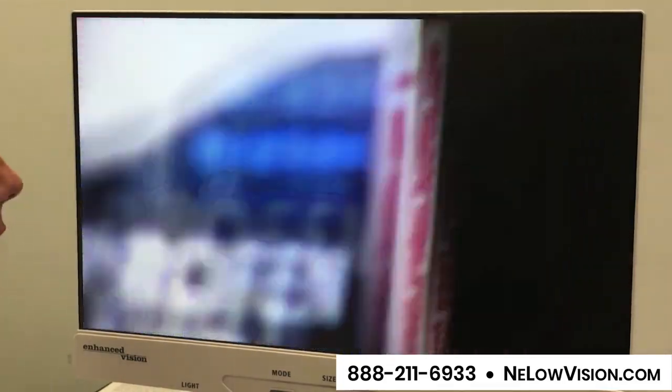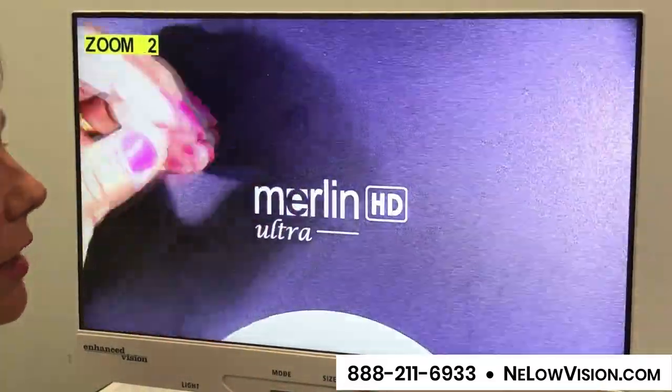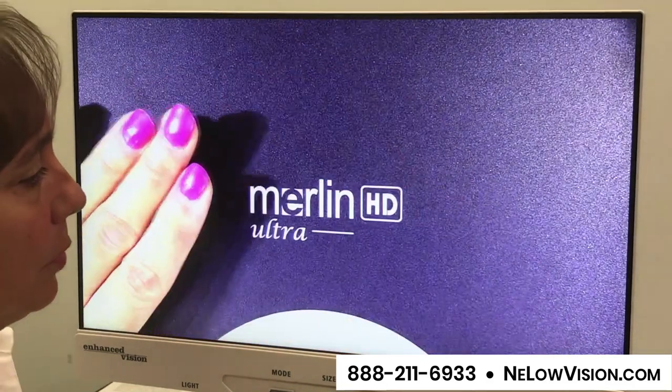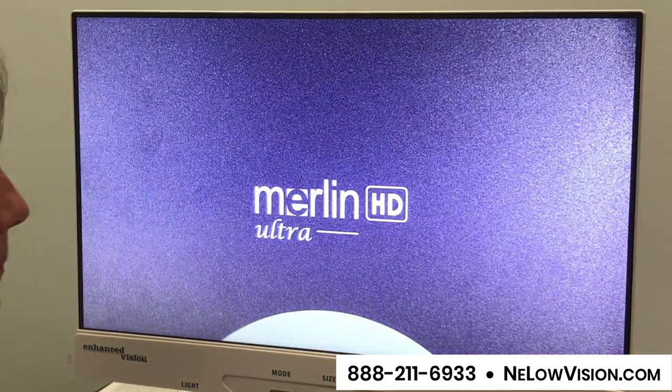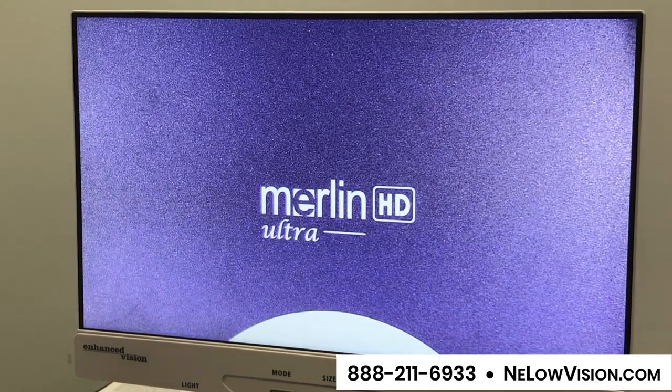So appointment cards, your phone book — all these types of materials you're going to be able to put underneath your Merlin Ultra. And you can even do your nails, as I sit here and put my hand underneath. Just about anything can take place underneath your Merlin Ultra 24.